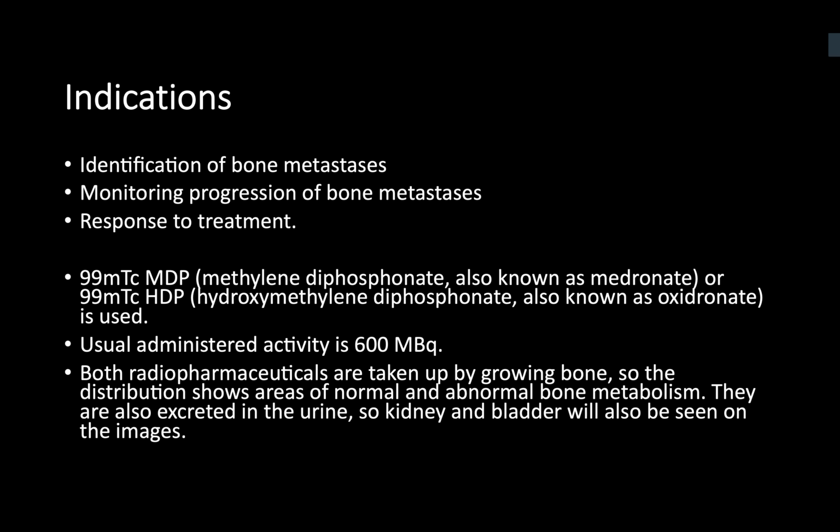So there are a lot of phosphonates related to bone scan, bone health, bone recovery. So you can remember it like it's MDP, methylene diphosphonate. That's most commonly used in our hospitals. But there is another one called HDP as well, which is basically the hydroxy component of MDP. Okay.